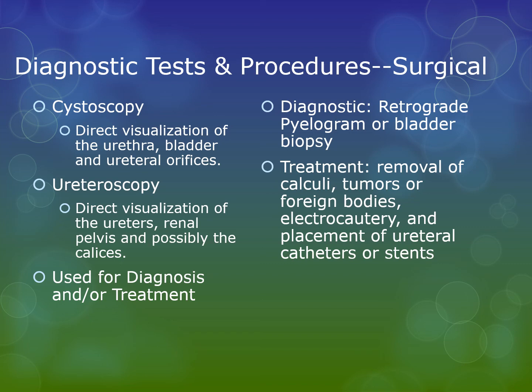With the ureteroscope, we can primarily diagnose things and treat ureteral stones. We can also place stents, so that if we need to keep the ureter open, that stent will help us maintain the patency of that ureter.